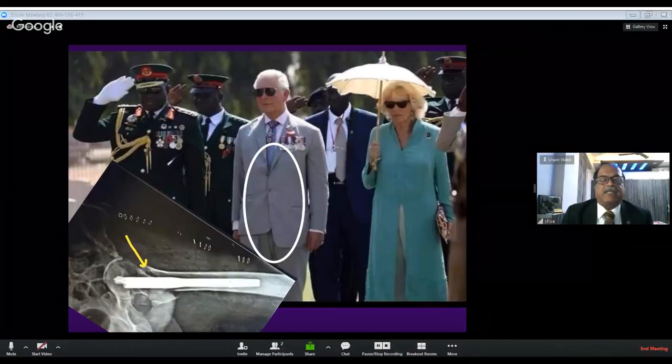Here is a lateral picture. You can see, though the implant is properly positioned, there is so much translation, and you can see the fracture line is oblique and there are shearing forces going on. The contact of the neck with the shaft is hardly anything. So this fracture is going to give trouble, though in AP it might be looking beautiful.